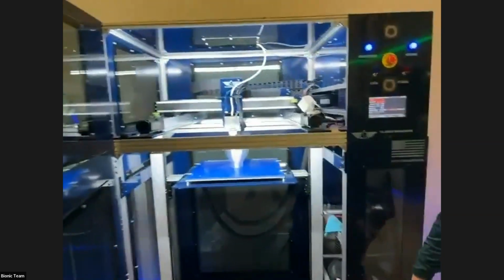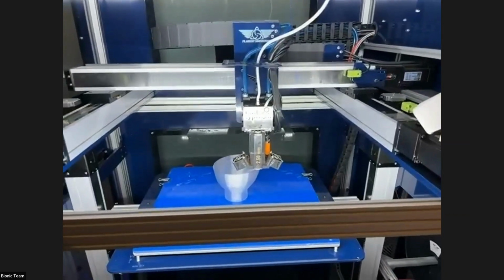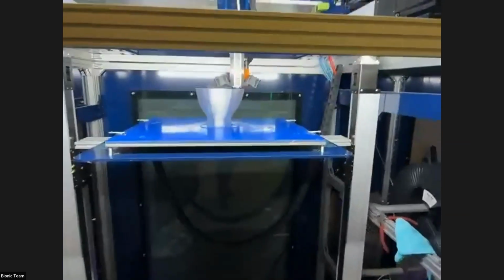This is a high flow printer. So when we're printing here, we're printing one solid layer. This material is Vivak or PETG. So when we're finished with this, there's no lattice structure between it. It's one solid piece of PETG, which has adapted really well into our clinical experience because PETG is a material that we're used to working with every day. It heats up like PETG, it grinds like PETG, you can make adjustments on it like PETG. It has all the properties of a PETG socket.